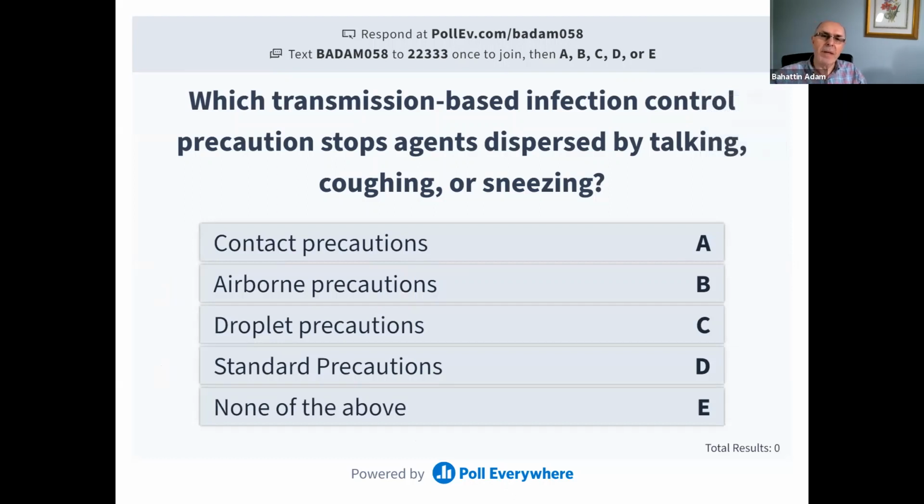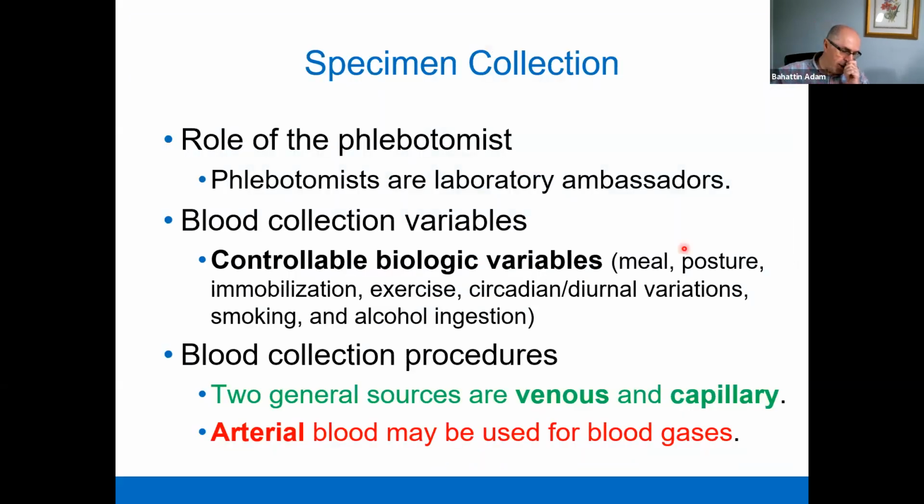Okay. Now, specimen collection is the most important step of the total quality of clinical labs, and the phlebotomists are laboratory ambassadors.